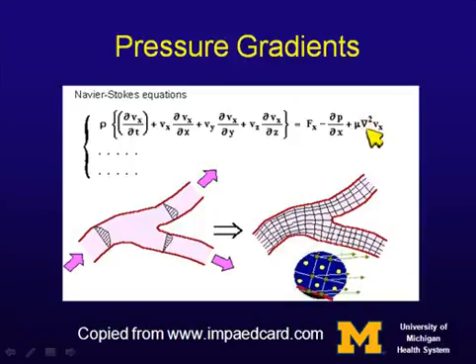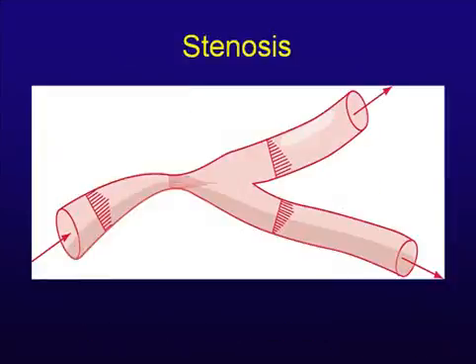We've got all the data. We just have to make sure that we can overcome the noise. We can then solve for the pressure gradient in x. We have to do this for all the other equations. However, remember, this does not have to be done in real time. We're competing with a clearly non-real-time technique. And so this now becomes a potentially viable solution using, if we have true 3D, 4D.